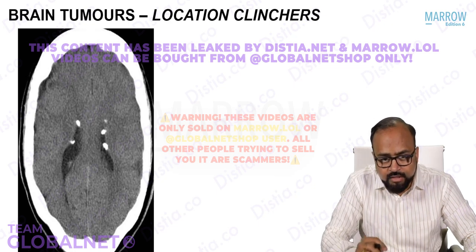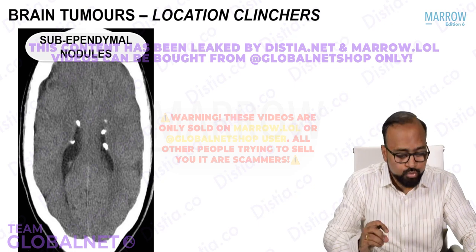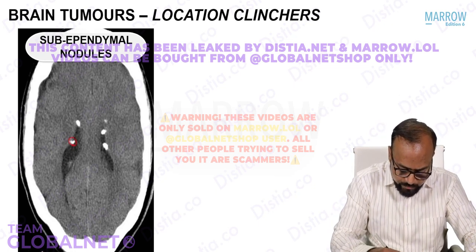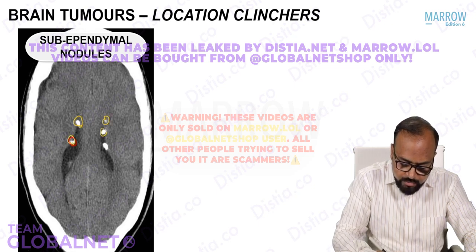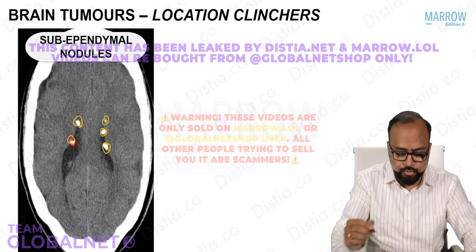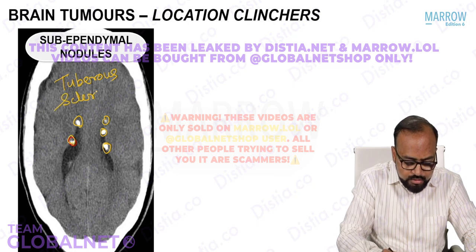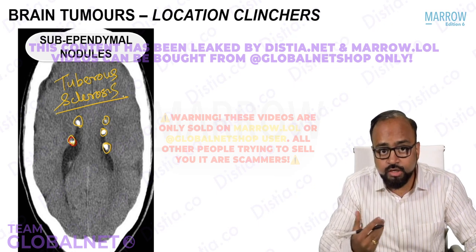Now another very typical appearance is the presence of subependymal nodules. See, along the ventricular system, along the ependymal margin, you are able to see these multiple subependymal nodules. These subependymal nodules are pathognomonic for one particular neurocutaneous syndrome, and that is tuberous sclerosis. Tuberous sclerosis. Now, these subependymal nodules may progress to a tumor.